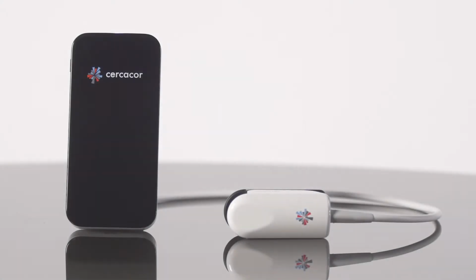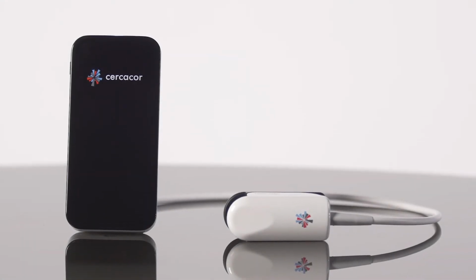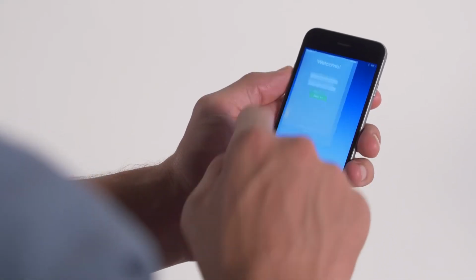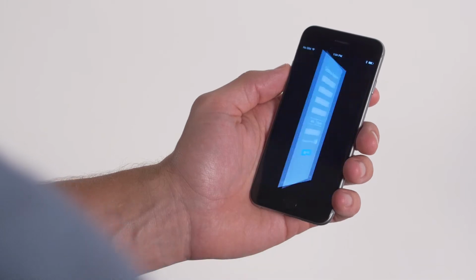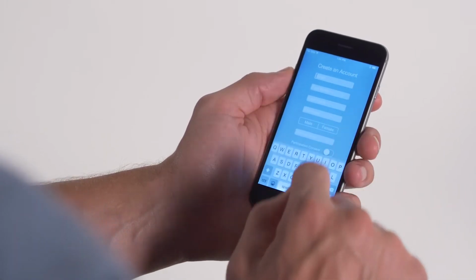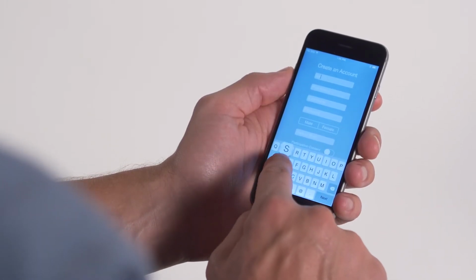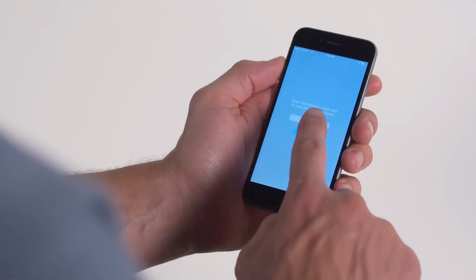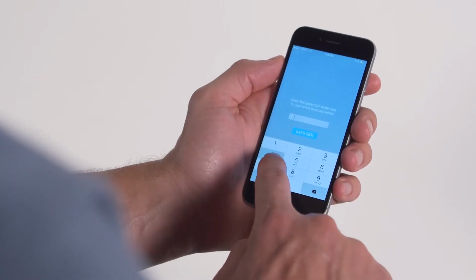Let's walk through how to use your Ember device along with your Ember app. After you download the free Ember app from the Apple App Store, open the app, tap Sign Up at the bottom of the page, and answer the questions to create an account. Then press Sign Up and an activation code is sent to your email address. Enter the code into the app and now you're set.